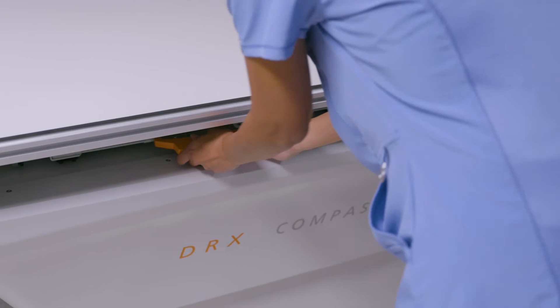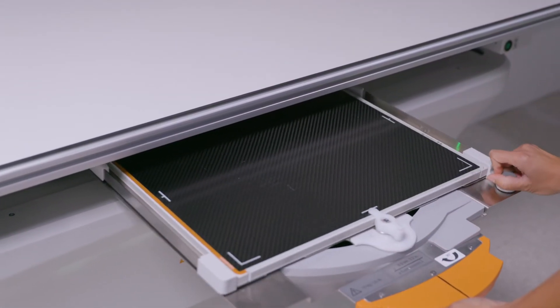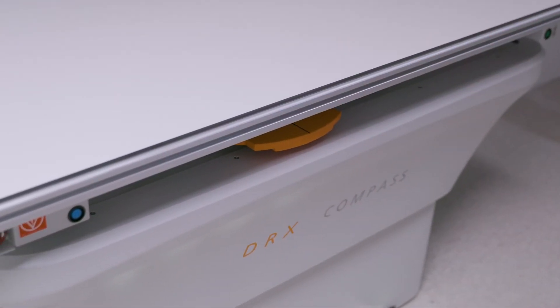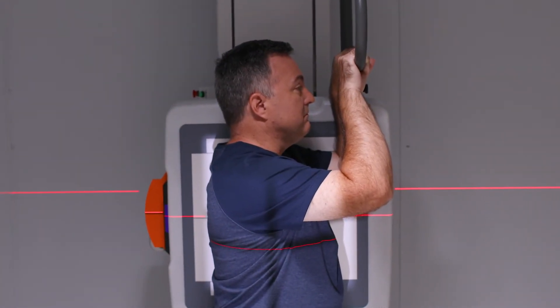The bucky in the table and wall stand makes it easy to rotate the detector from landscape to portrait mode without removing it. The system has auto-centering, which means it delivers amazing productivity in this class of system.